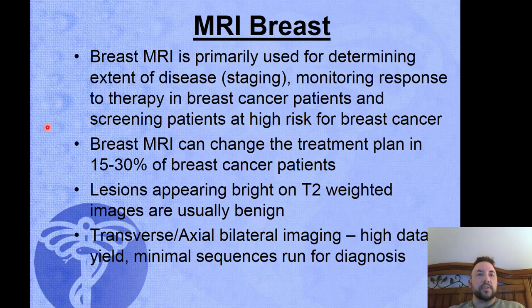So it's crucial for us with speed, and then also, again, the same recurring theme as we've been discussing in recent weeks, the shimming is crucial in achieving optimal homogeneity. It's a crucial portion of our work in getting the most homogeneous scans that we can acquire. With breast MR, it's really important to ensure that the patient is changed completely, that they're free from any metal. The power injector is a half meter from the edge of the magnet. All of these tips and tricks ensure the best imaging possible.